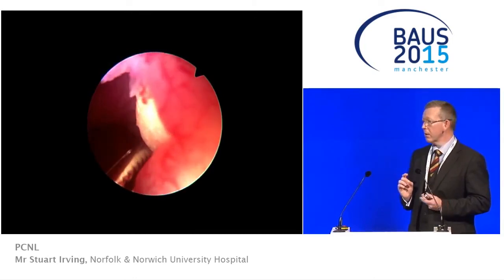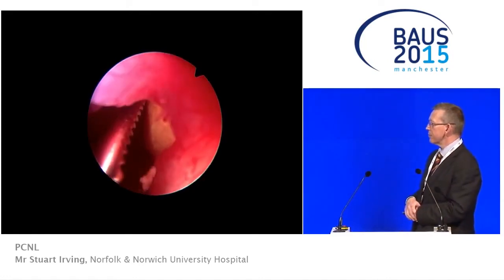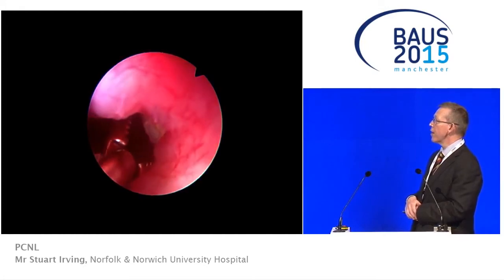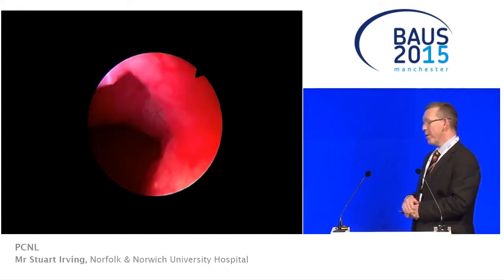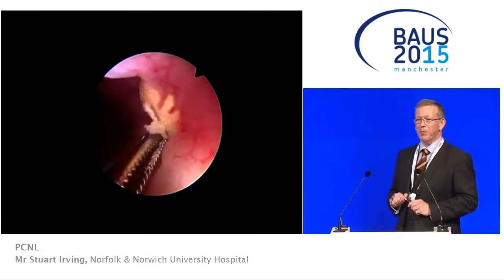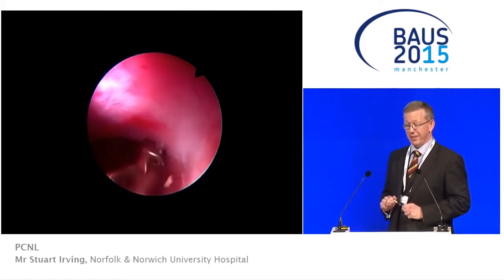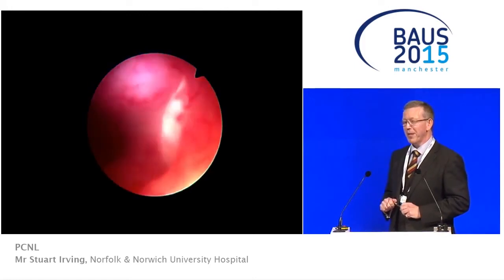While you're doing this, I'll just ask you another question, which is how many flexible ureteroscopes have you damaged doing this procedure? Don't shoot the messenger, I'm just passing the question on. Without blowing our unit's trumpet, we did win the prize last year for getting the most uses out of a flexible ureteroscope. So thankfully not many.